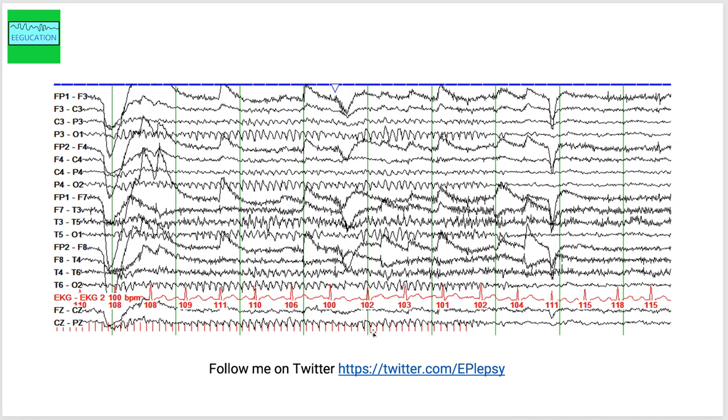You can count the number of stimulations, the photic stimulation that are being used. So 1, 2, 3, 4, 5, 6, 7, 9, 10, and then you see in the occipital head region there are 10 waves that correspond with the flashing lights. This is called a photic driving response and which is normal.